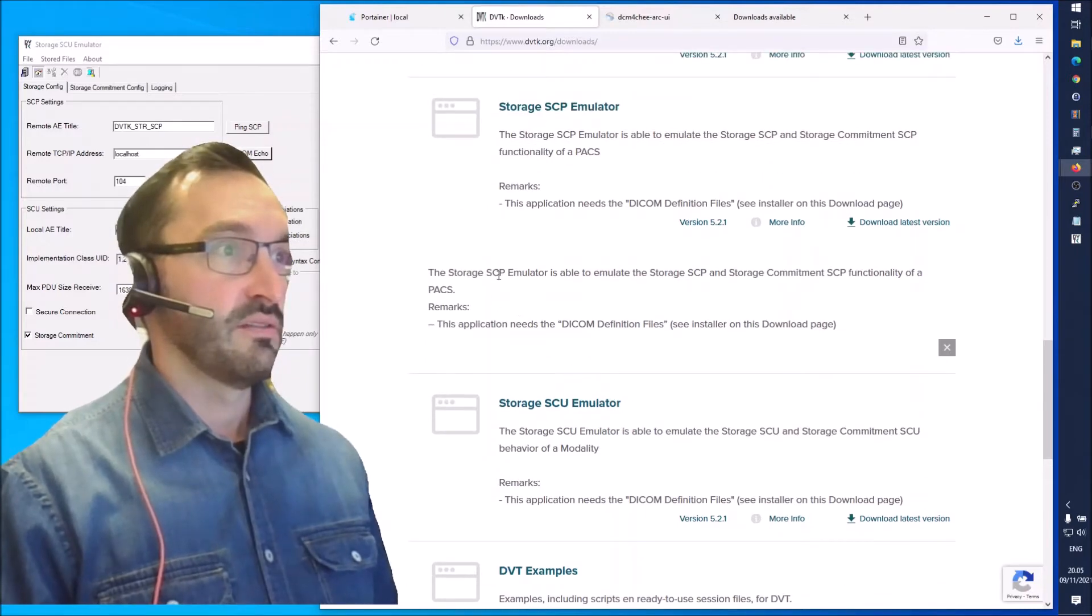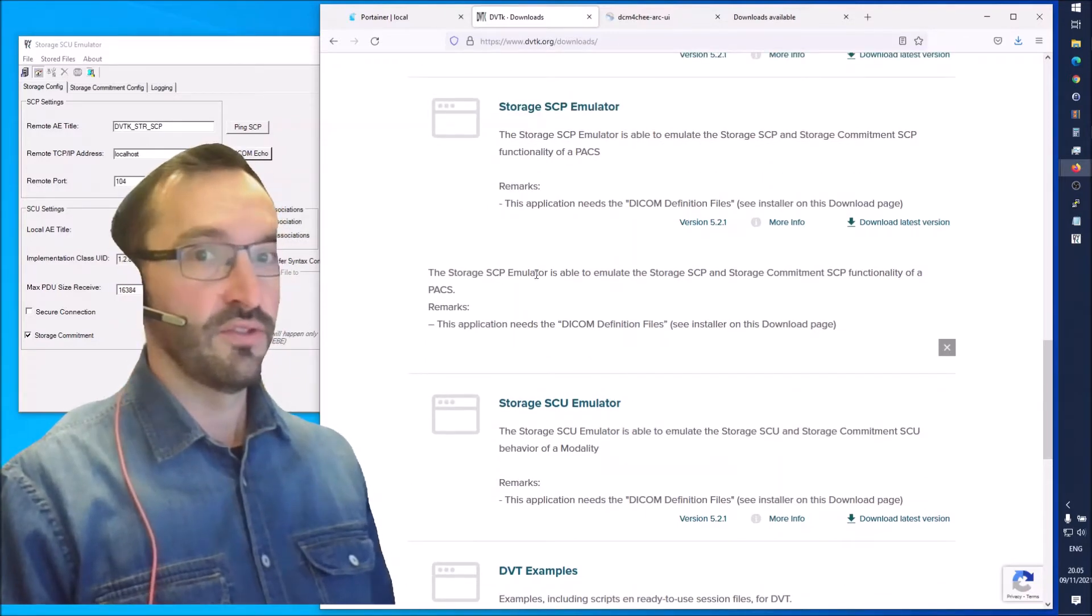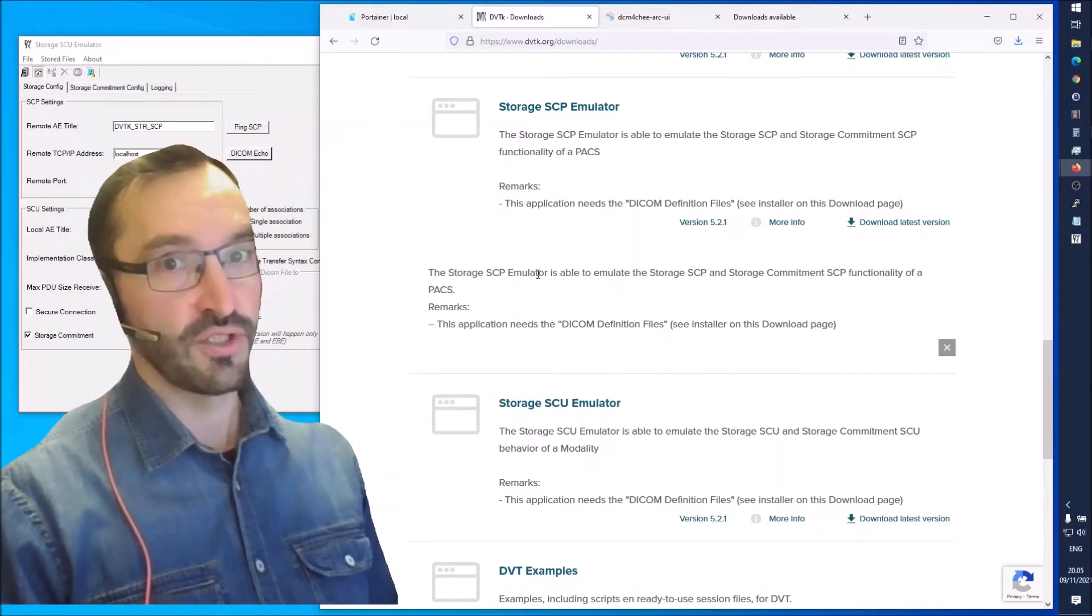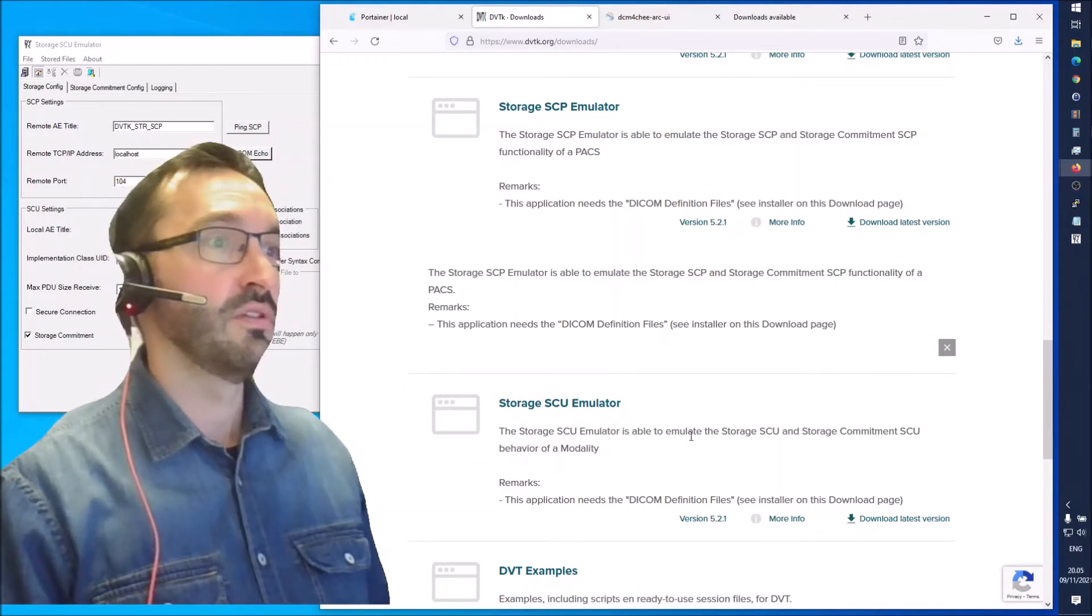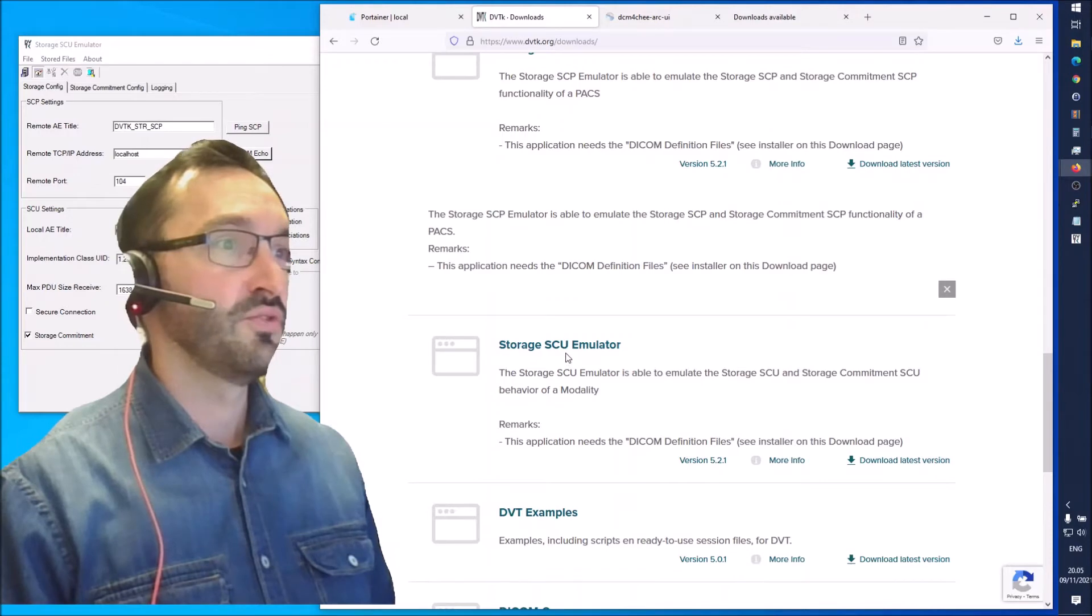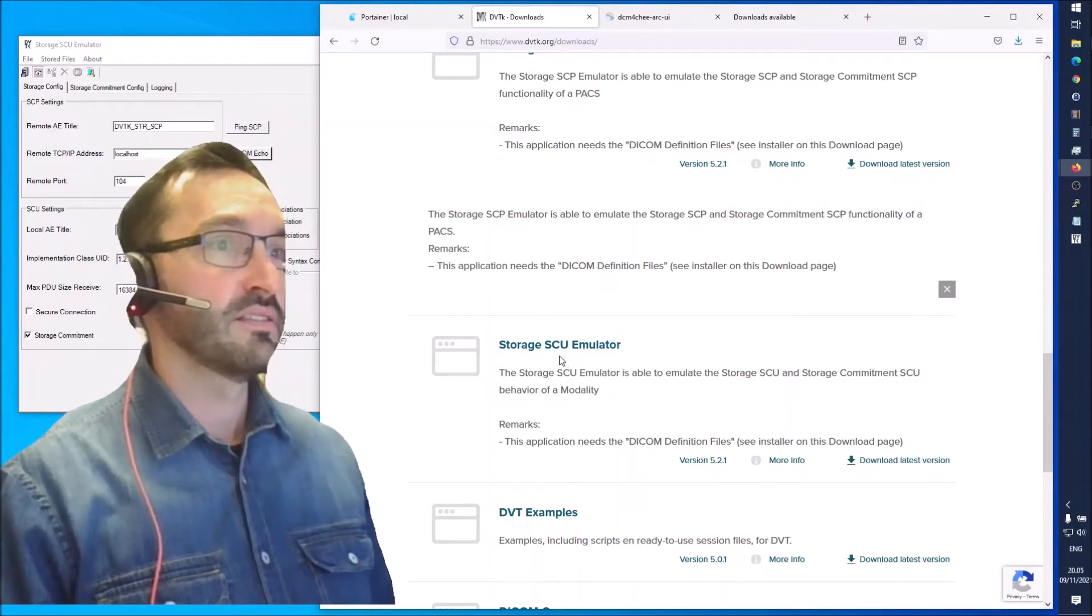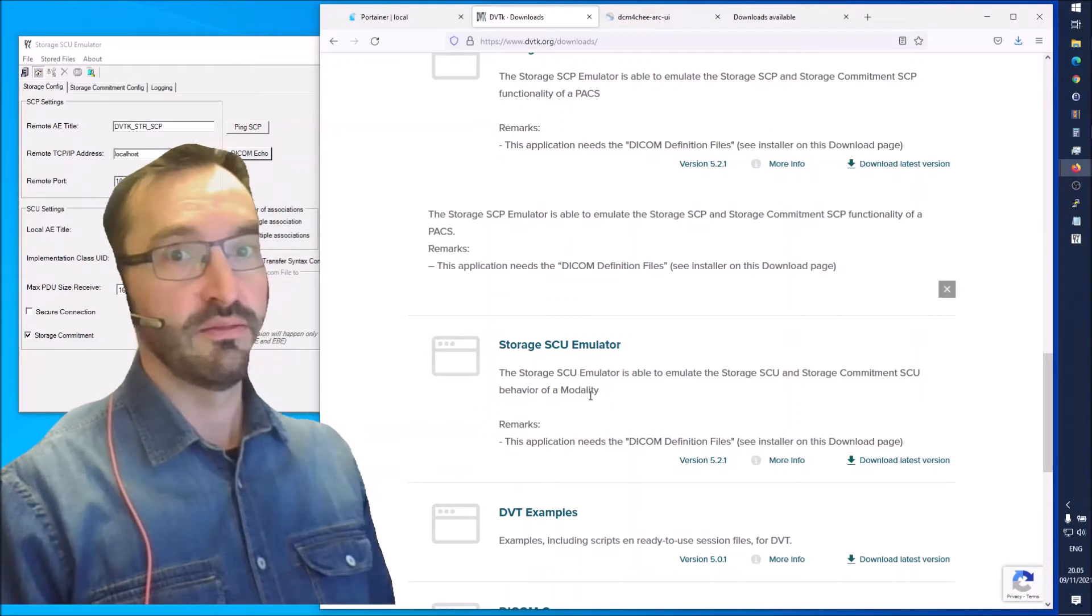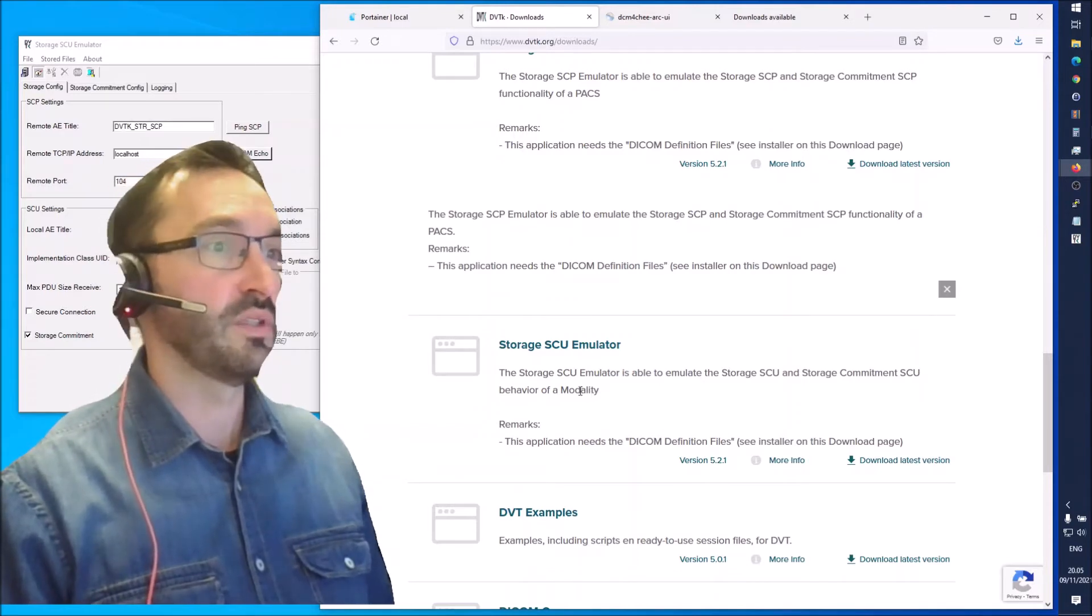This acts as a modality and enables you to send studies to a DICOM SCP. SCP is the service class provider, the server side. The Daikon4G VNA is in that role, and the SCU is the client side and a modality would be in that role.